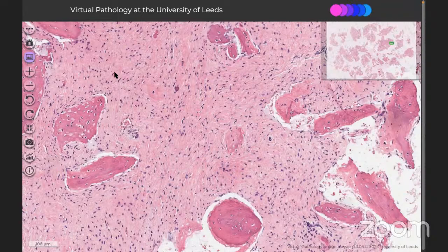So these remarks you can give, and in another line, you can say that the differential can be osteofibrous dysplasia. In that setting, the irregular bones or these haphazardly arranged bones will be lined by active osteoblasts. The lesion becomes osteofibrous dysplasia, and in that case, the lesional cells will be positive for CK. So this is one helpful immunohistochemistry you can use to differentiate from osteofibrous dysplasia.